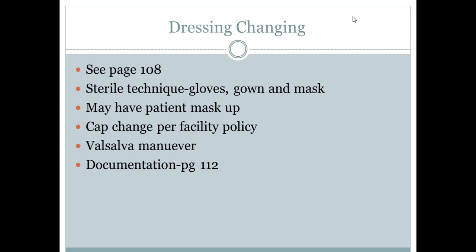So it's important that you flush all of them and that you use heparin if need be according to your facility policy. But if you are having problems flushing a line, do not force it. Again, in the skills lab, we'll talk about correct technique when you go to flush it, because it is a little bit different. You kind of use a little pump technique for the pressure. But if you have a lumen that will not flush, do not force it and let the RN know. That doctor will then decide the next step, whether to do an x-ray to see if there's a kink or if there's something going on. That doctor is the one who's going to be writing an order to check it out. So that type of thing is considered emergent, to where you would contact your RN or your supervisor to let them know what's going on.